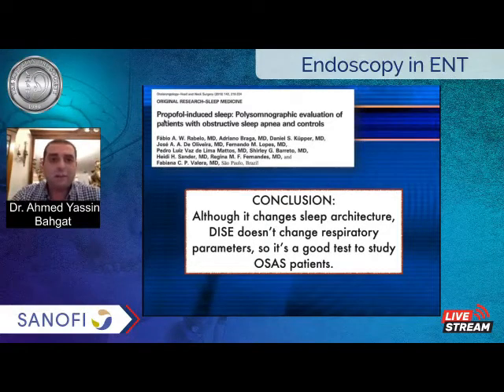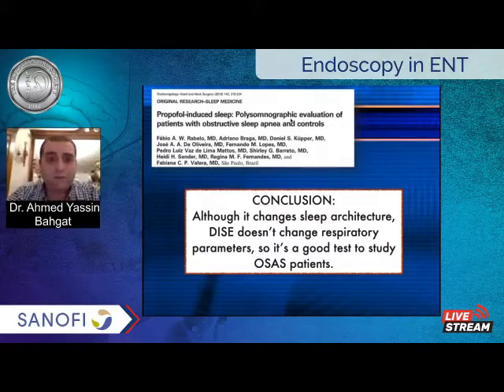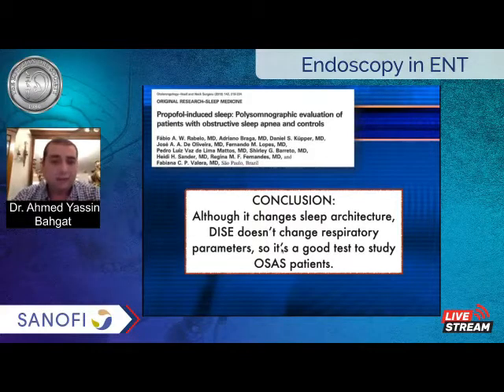But this is the answer. Here's a study made by a group of Brazilian surgeons. They studied propofol-induced sleep, and they performed polysomnography and EEG for patients, natural sleep versus drug-induced sleep. And they found that you may not have a perfect EEG image during drug-induced sleep, but you can have the same respiratory patterns as in natural sleep. So the same apnea hypopnea index, same degree of collapse, same sites of collapse. So you can use propofol-induced sleep as a method to detect what's going on during natural sleep. It's not natural sleep, but it's the same degree and same pattern of obstruction as natural sleep.